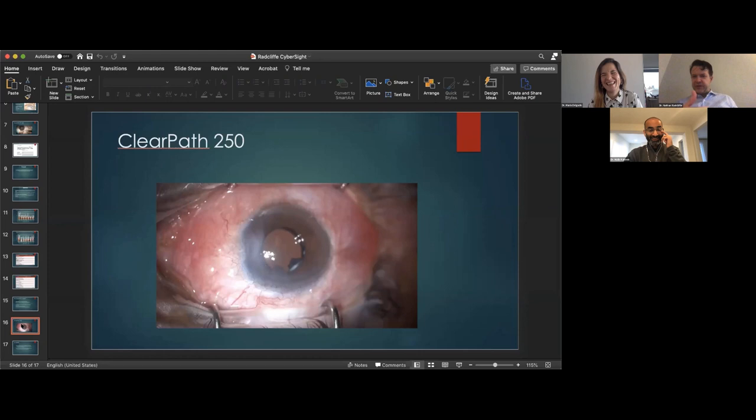So you had nice lax conge, but if you're in a situation where the conge is tight and there's tension, glue can't really overcome tissue tension. It's just there to sort of keep things in place. And one of the things I have to say that you probably don't is I tell the patient, you know, you could undo my surgery by rubbing your eyes.